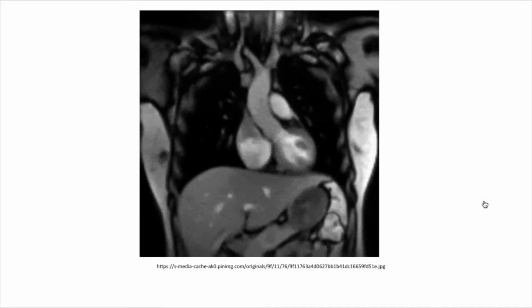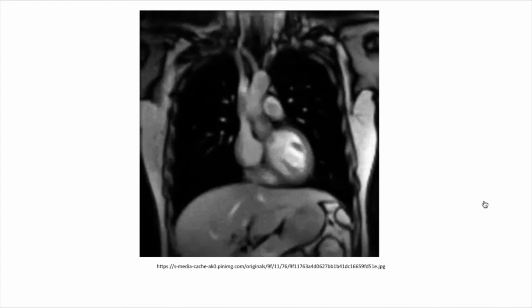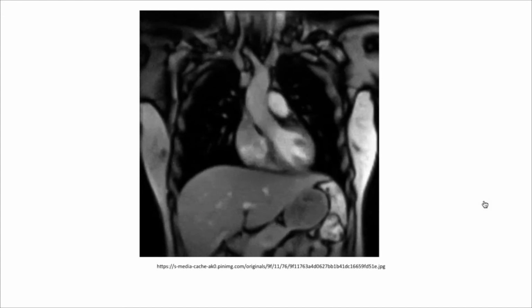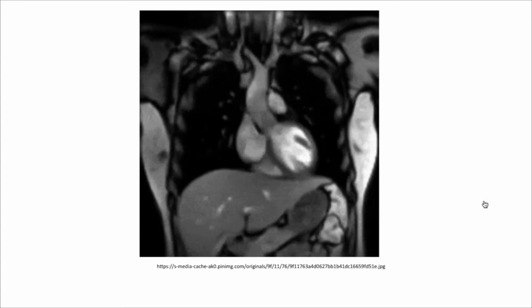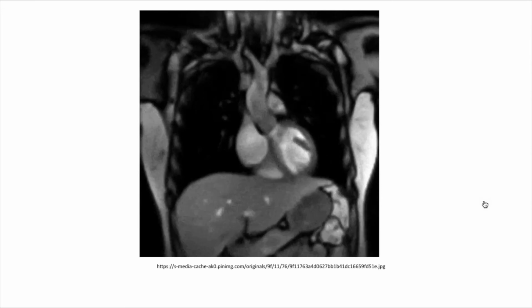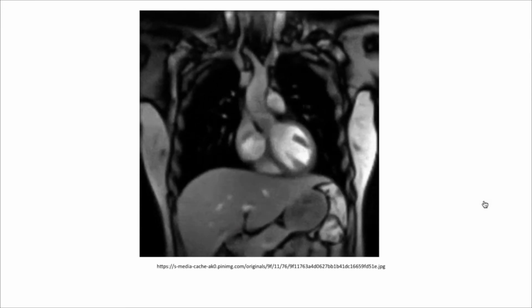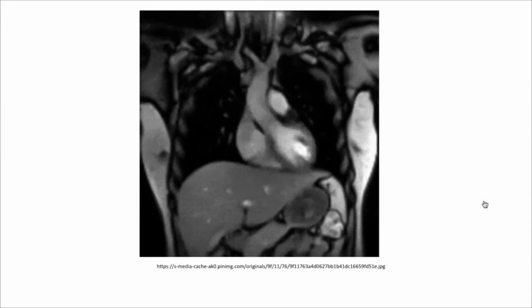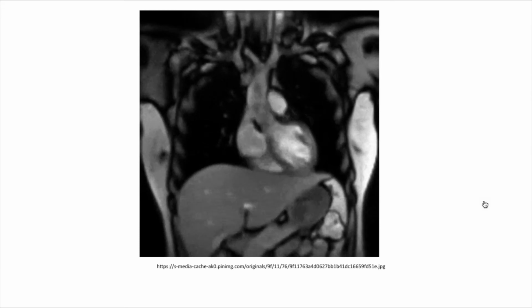So this is just a quick video to take a look at what happens from the diaphragm. Unfortunately, the video didn't translate down towards the pelvic floor, but again, as you take a breath in, that diaphragm is descending and we get that inferior translation. So remembering that our organs move, and as we take a breath in, there is pressure that translates towards that pelvic floor, and we get that eccentric elongation and that concentric shortening.